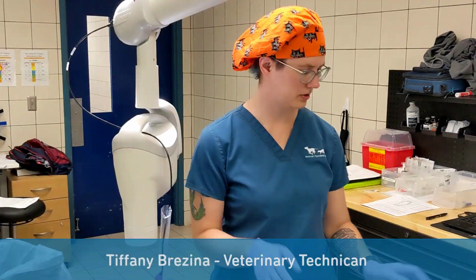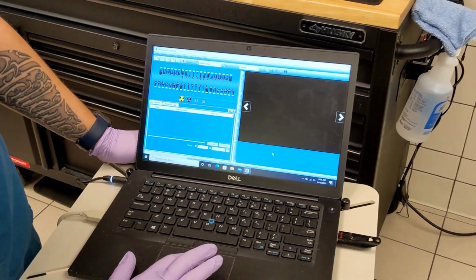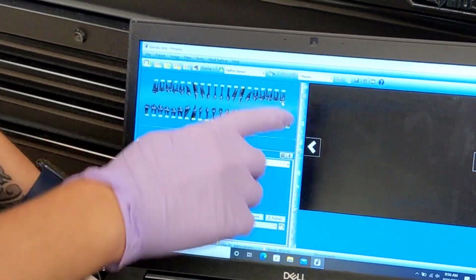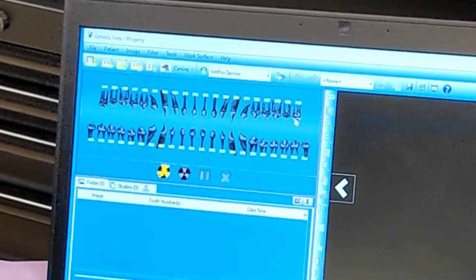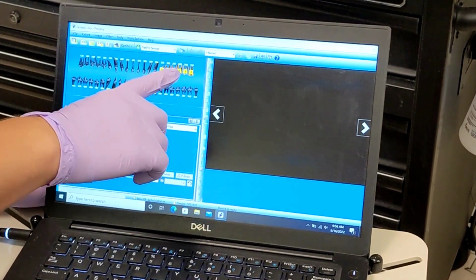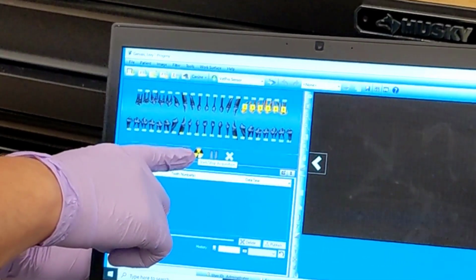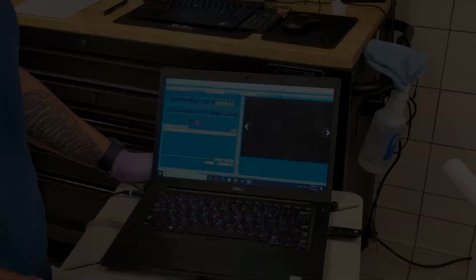What I'm going to do first is, you see on here, I'm going to select the teeth that I'm going to take a picture of. So I'm starting on the 200 side, so I'm going to start as far back on the upper arcade as I can and go as far forward as I can. So I'm going to select and then drag the teeth I'm going to try to take, and then release them. So I'm going to take a photo of those teeth. And then to actually take the photo, I need to hit this little beach ball looking radiation symbol here. And when it's red, it's ready to take a shot.